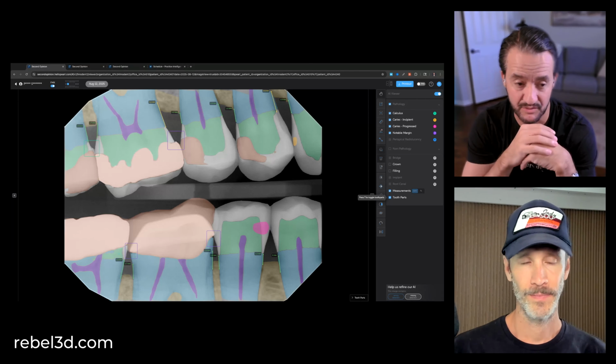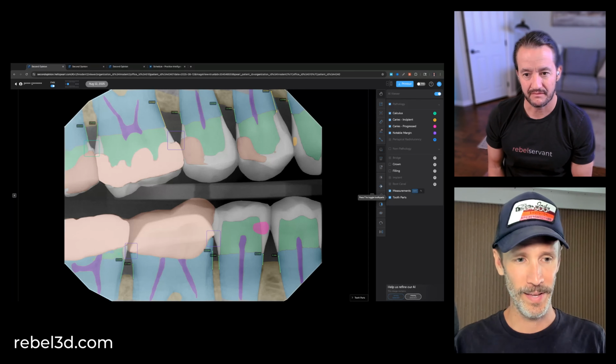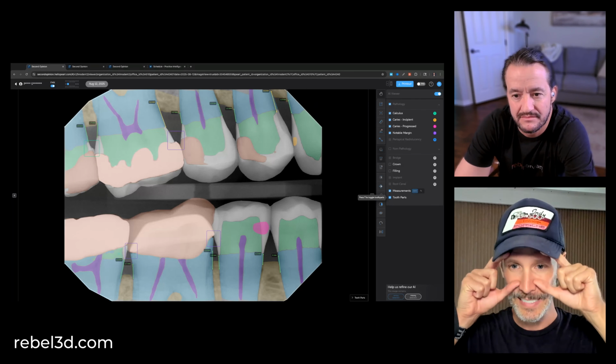You should trust me. Yeah, what I say about these sometimes is it's kind of like, have you seen those videos of people who are colorblind getting those special glasses, and then all of a sudden they can see the world and they start crying? It's kind of like this with our patients. This is what we doctors see, but the patient sees this. We see this, they see this. So it's like giving them goggles they can put on and go, oh my gosh, that's what you see?